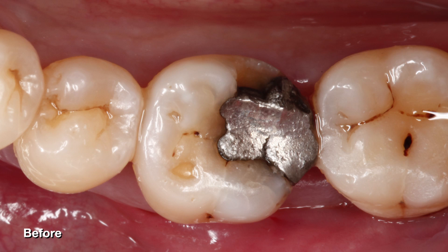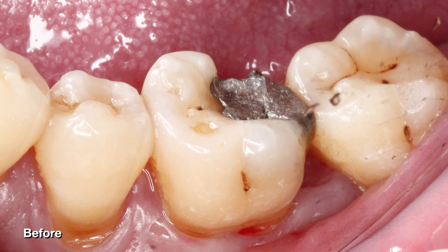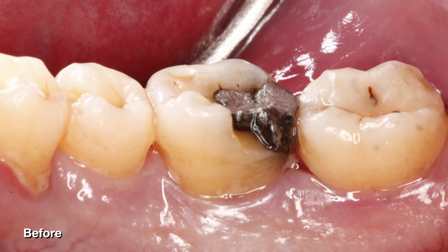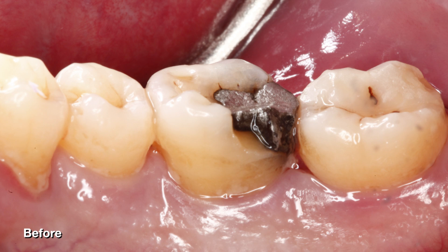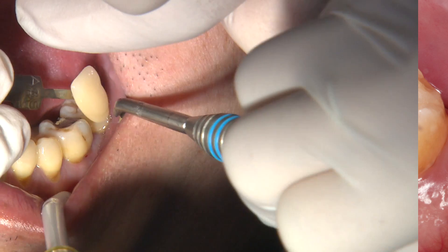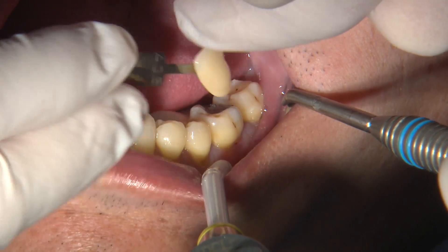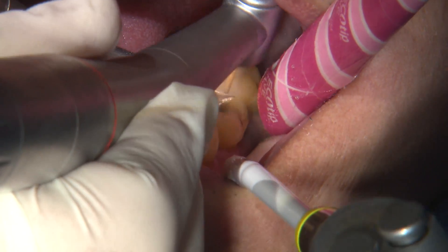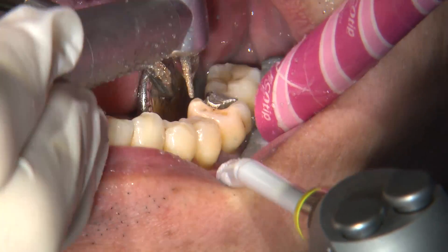Let's take a look at this case. This patient presents with a large amalgam restoration on tooth number 19 with the distal lingual cusp that had sheared off. This is a situation I see fairly often, and I'll utilize a digital process to restore this patient's problem. After taking the shade, which we determined to be A3.5, I'll start by removing the retentive areas of the amalgam restoration, and it just easily pops right out.